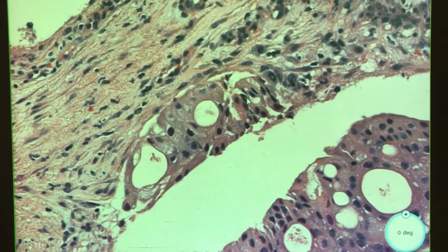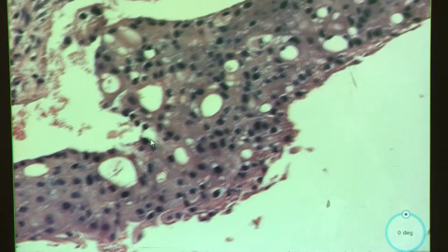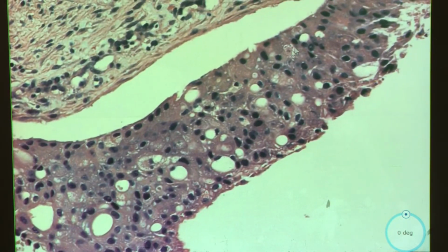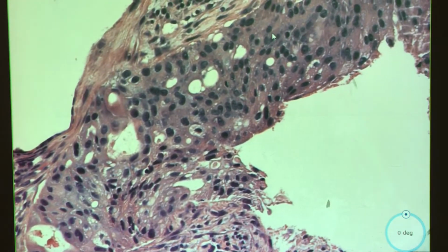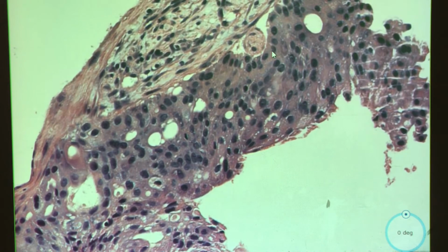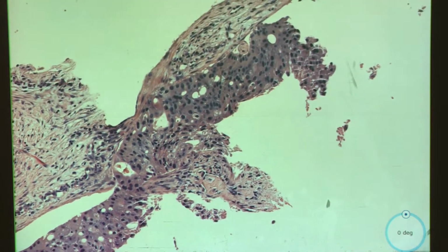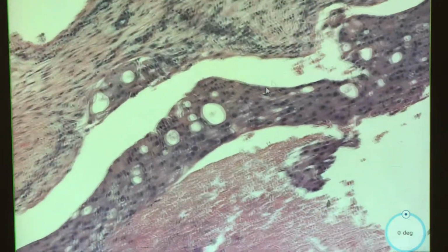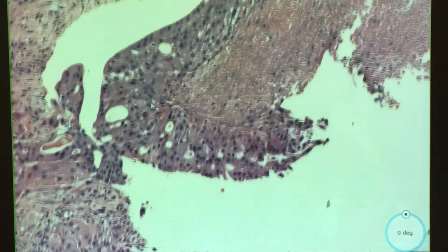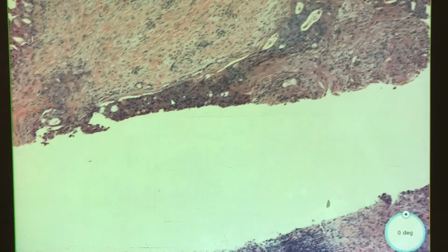These are hard lesions though. I don't think anyone who signs out breast pathology will ever stand up and say, hey, metaplastic lesions, so easy. But I think that's kind of the differential to have. It just, to me, looks like there's more dyskeratotic cells in here than anything, but those kind of like acinar areas or cytoplasmic.